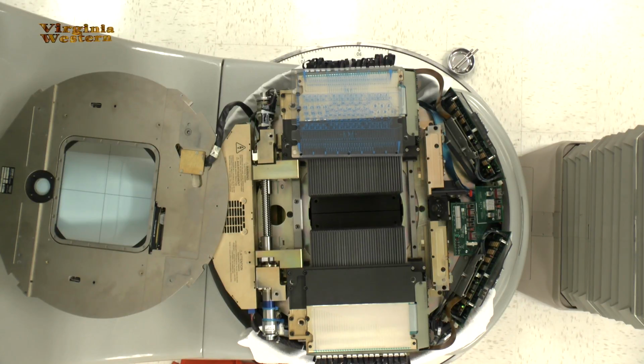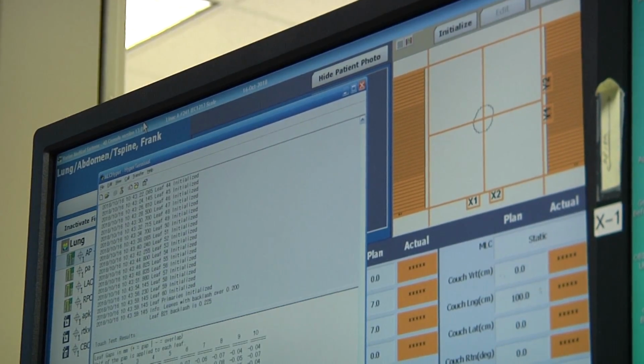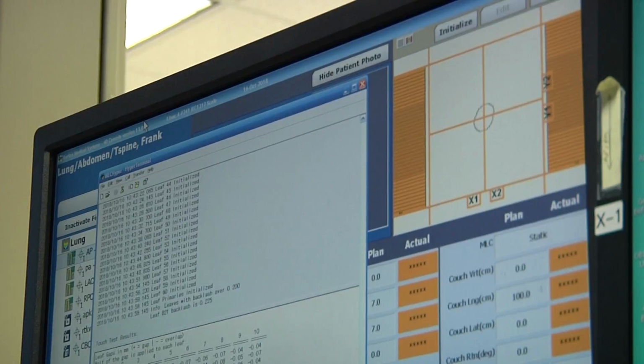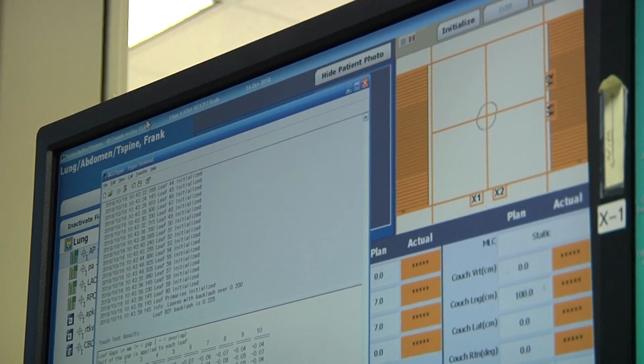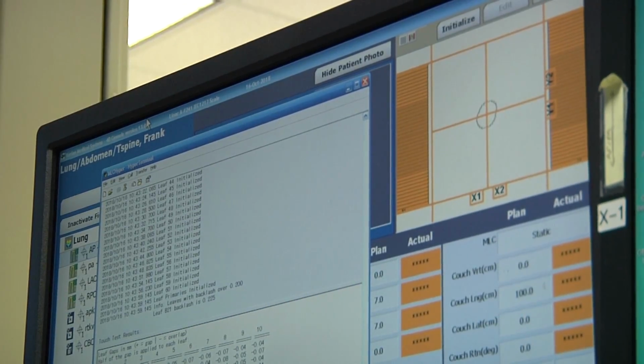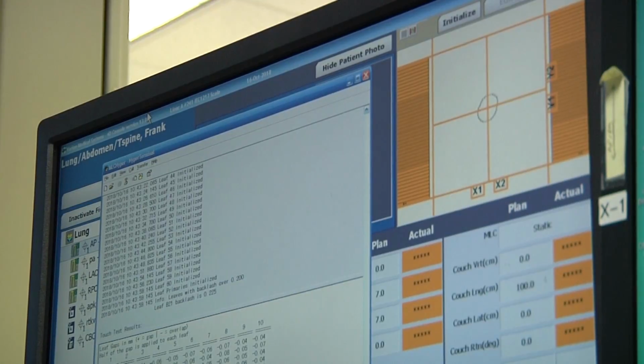Now what it's doing is it's checking to see that the soft pots, or your secondary feedback off those motors, is matching the primary of the motor itself. Okay, so we lucked out. That was a bad motor. We replaced the motor. That resolved the problem. This morning it wouldn't initialize.